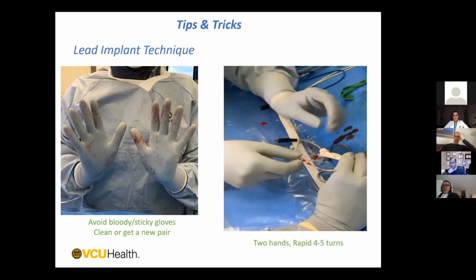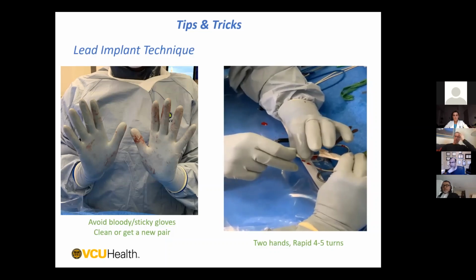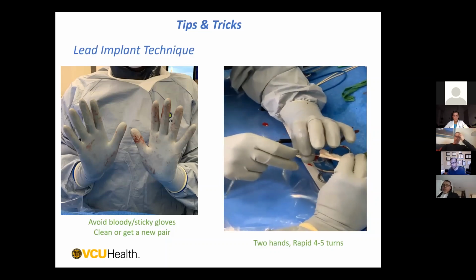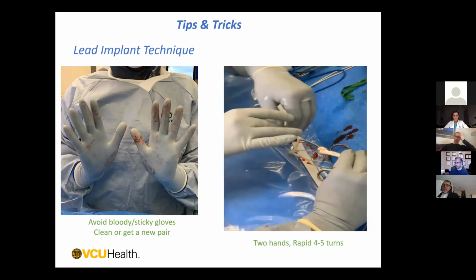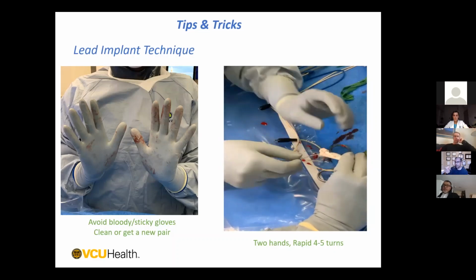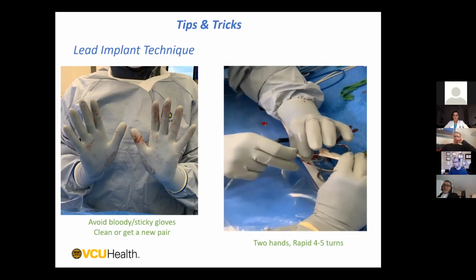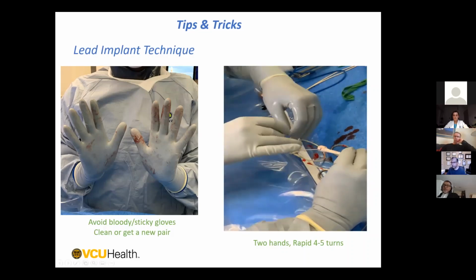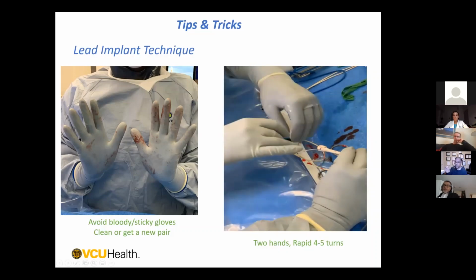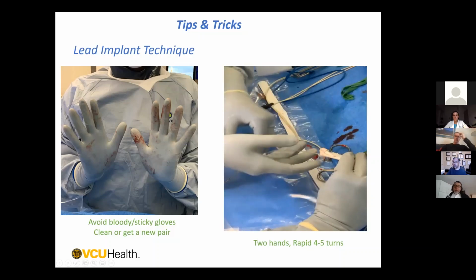I'm going to try it, Felix, pre-rotating the lead to make sure that the transmission is already there. One of the things that I sometimes do to transmit is, let's say I do 1 or 2 turns and I'm starting to get a bit of recoil. I'll stop rotating and just push the lead in and out a tiny bit, like this motion. That will help to transmit any built up torque to the tip of the lead. I'll often see that the lead is not going in when I'm just turning, but when I do that little movement, it will transmit the torque to the end of the lead.